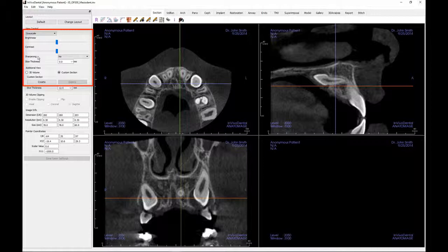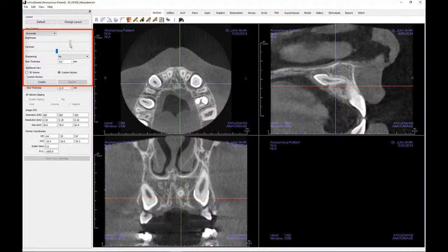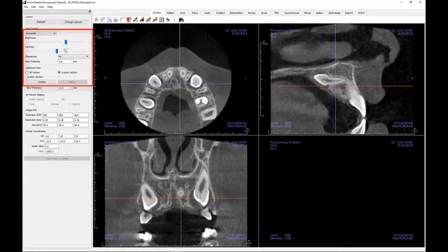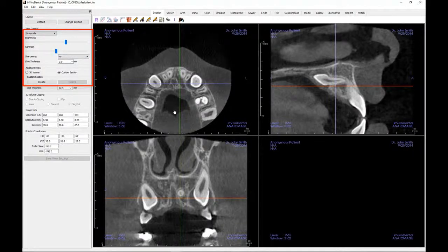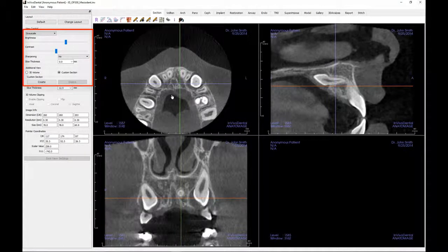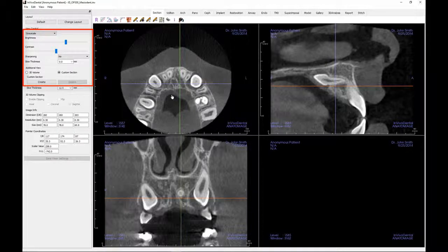Brightness and contrast can be adjusted for each of the presets to enhance the images in the rendering window. These sliders will adjust all the viewing windows at the same time. In the previous video, you learned how to adjust the brightness and contrast of each viewing window by left mouse clicking on a viewing window and dragging the mouse up and down for brightness and left to right for contrast.